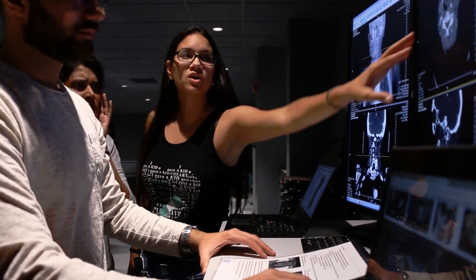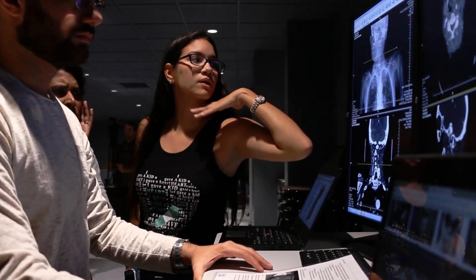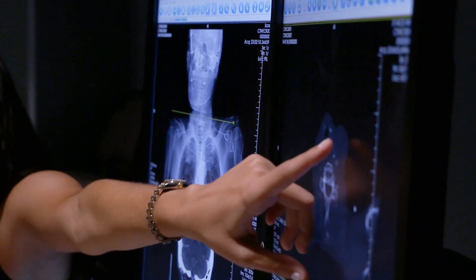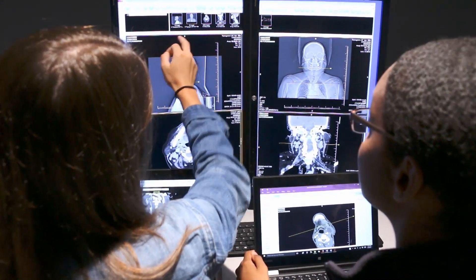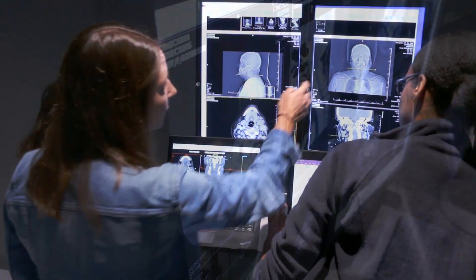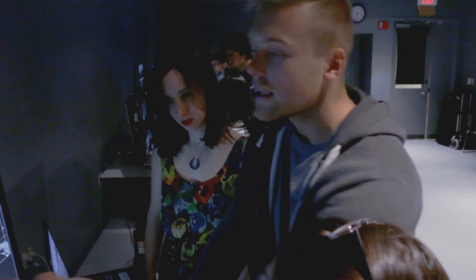Careful consideration was put into the design of the lab so that we would simulate what occurs in an actual clinical reading room. We have a dual monitor setup, and these students have their own computer system for viewing anonymized real cases that come from our UConn system.